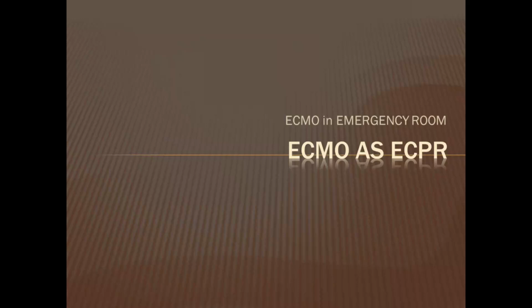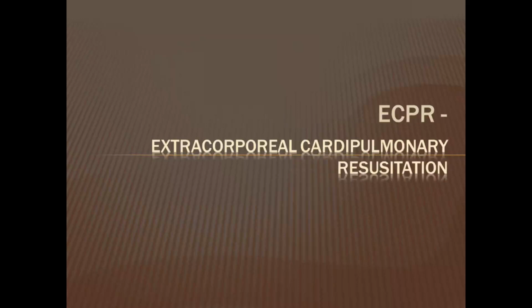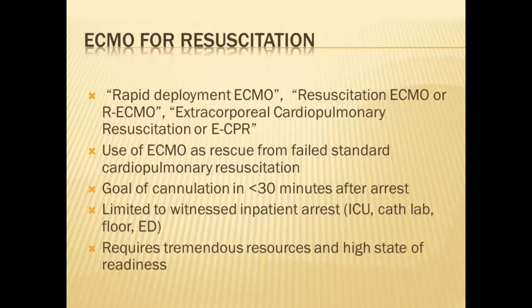Then ECMO can be used in the emergency room as ECMO ECPR, that's extracorporeal cardiopulmonary resuscitation. So that is also known as rapid deployment of ECMO. It is the use of ECMO as a rescue for a failed standard cardiopulmonary resuscitation (CPR). The basic goal is that you should be able to cannulate the patient within 30 minutes of arrest.